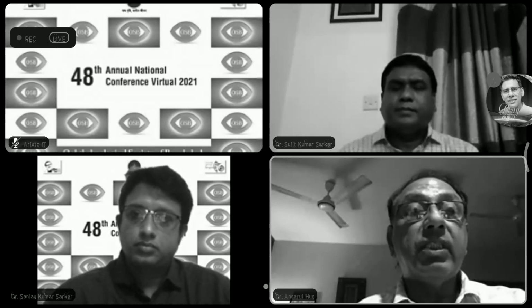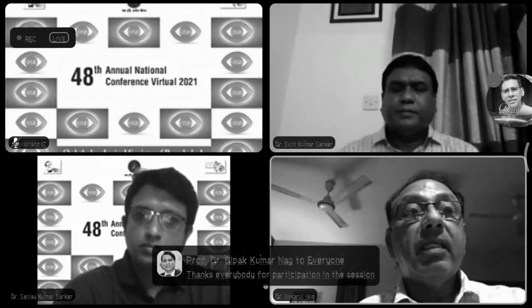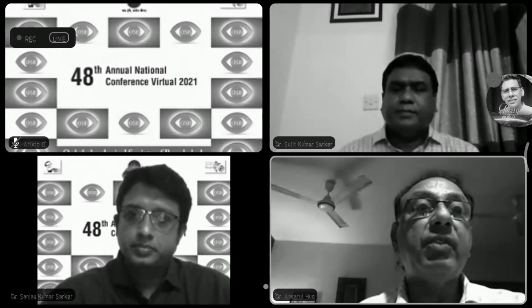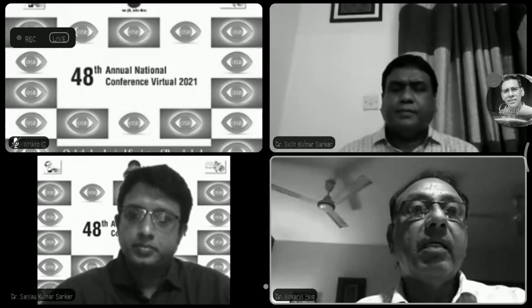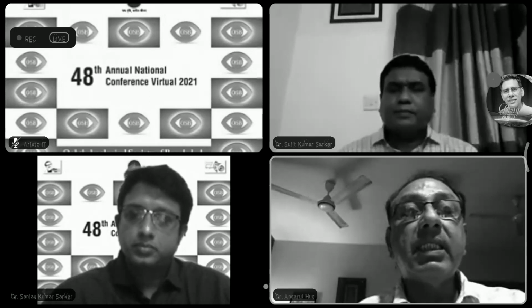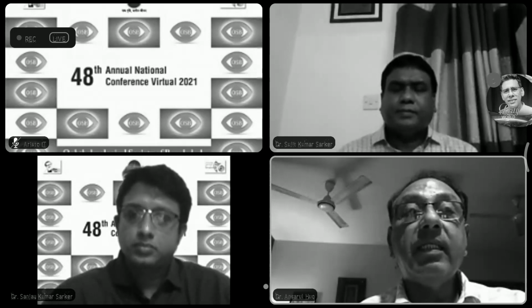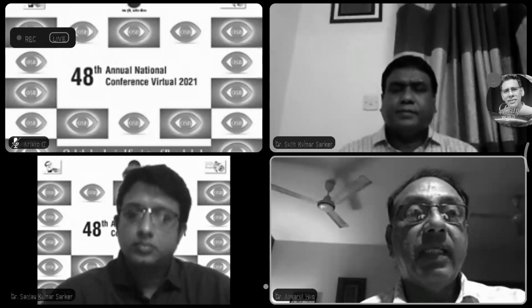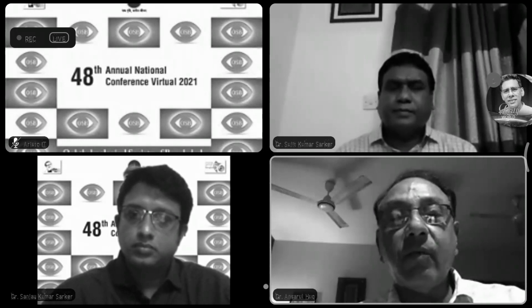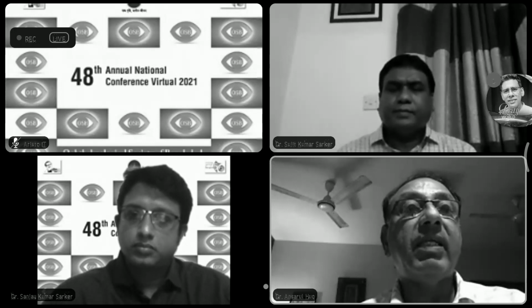But OCT has a double advantage, structural and functional. The OCT that we have, the spectral domain, only gives you the structural features of the retina, all the retinal diseases, but it doesn't tell much about the functional side, and that is where OCT angiography has come. That gives you both the functional and the structural changes. So this is just the sequence of how the imaging processes evolved, because of the limitations of one and the advantages of the other.